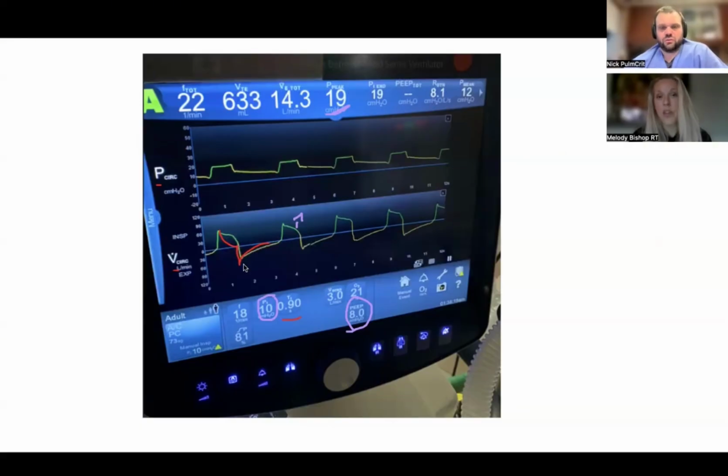In defense of pressure control, I do have to say, as long as the patient isn't working, it should be lower. But yes, I agree with you, and I think this is the nuance of ventilation. When it gets fun, when you can geek out, is because everything that is a rule has an asterisk beside it, because so many things can affect what is truth, even in a mode. The volume isn't always the volume in volume control. The flow isn't always the flow, and the pressure isn't always the pressure, which is why there's always nuance.